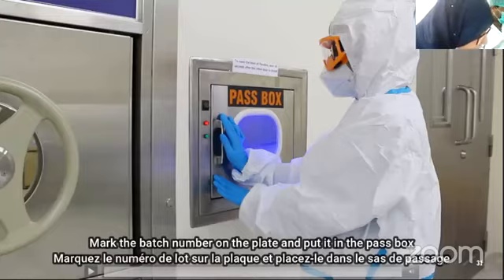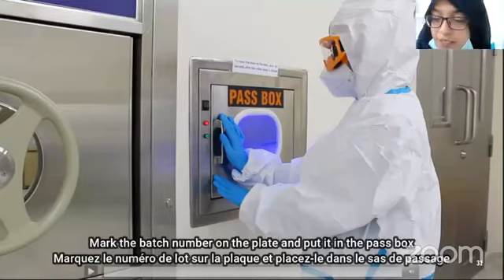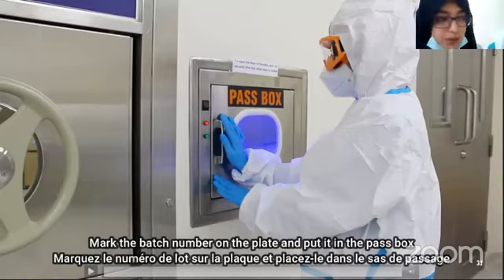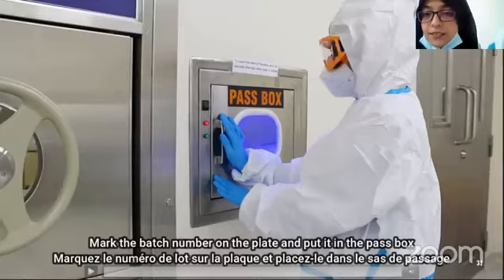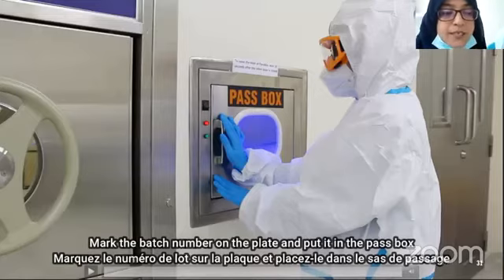Another question is, what type of internal control do you use in this case? So the internal control we are using basically depends upon the PCR kit, and it contains the control template RNA that is extracted during the RNA extraction, and the proper probe primer mix contains the primer targeting this RNA. So it is included in the PCR kit, like internal extraction control.